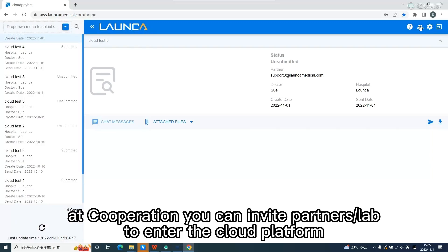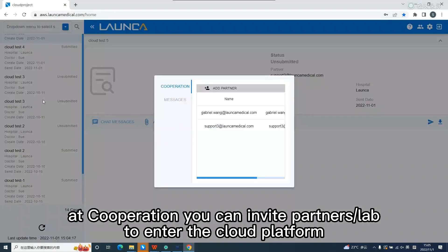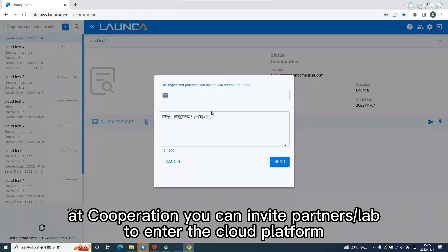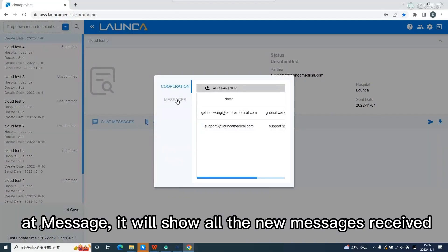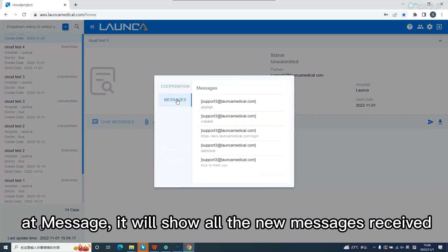Click partners. At cooperation you can invite partners or lab to enter the cloud platform, enter the email, click send. At message, it will show all the new messages received.